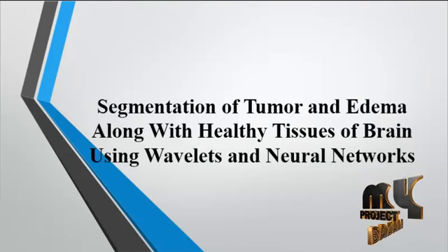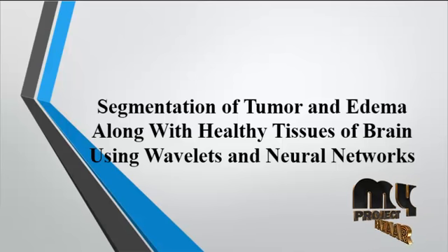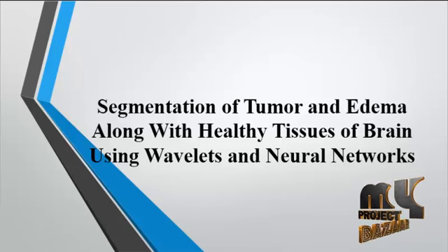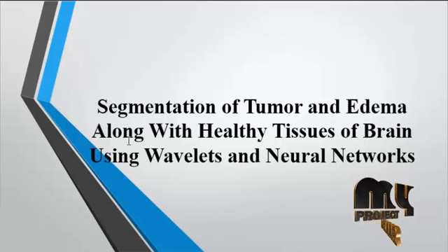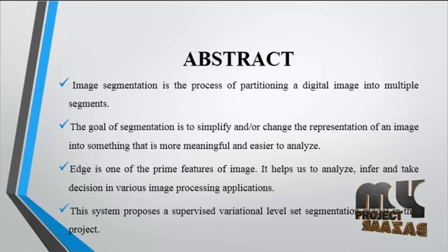Now we discuss the segmentation of tumor and edema along with healthy tissues of the brain using wavelet and neural networks. Now we discuss the abstract for the process.